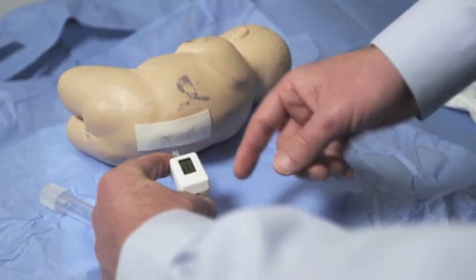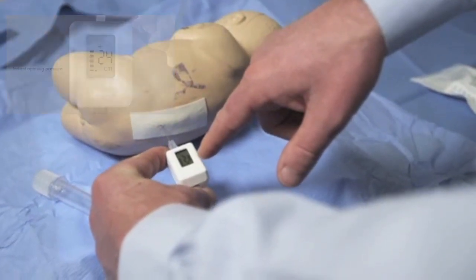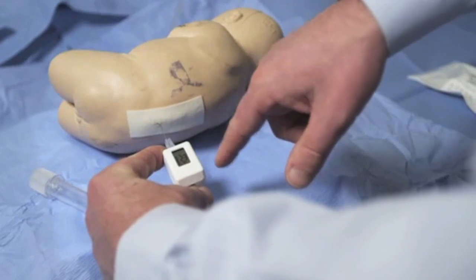Cover the rear of the device to obtain the opening pressure — in this case, 23 centimeters.